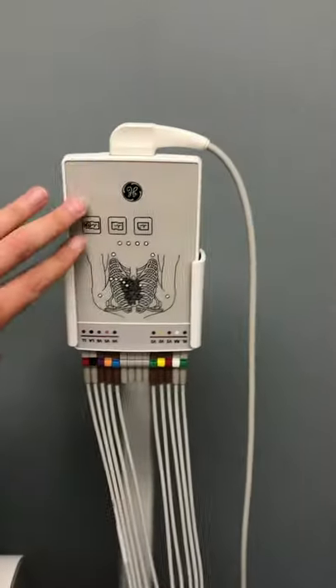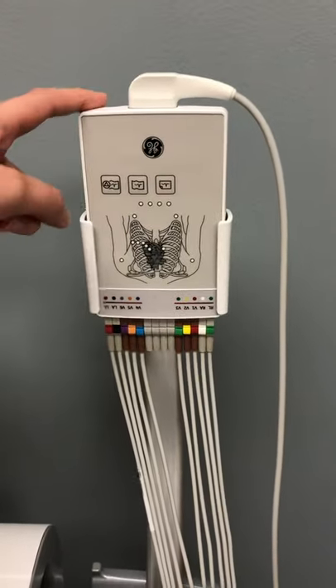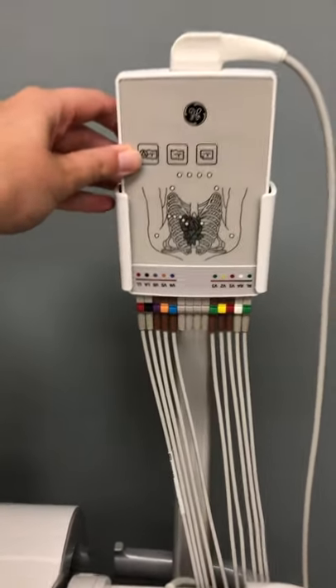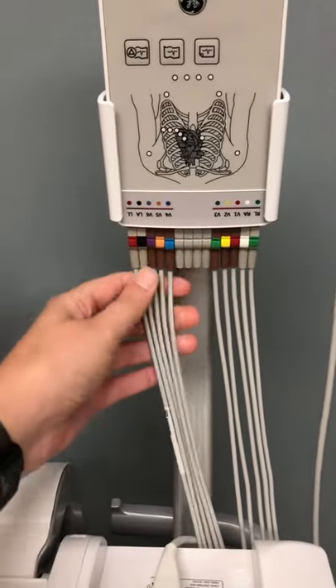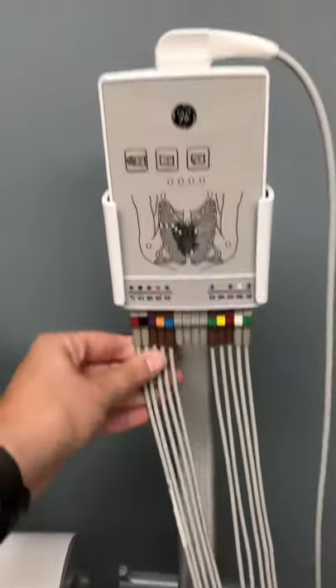Around the back, we have purple sani wipes and a set of gloves. Up top, you'll see the lead box. This does need to sit upside down in its holder — this is to help prevent wear and tear of the leads, so make sure this is upside down.